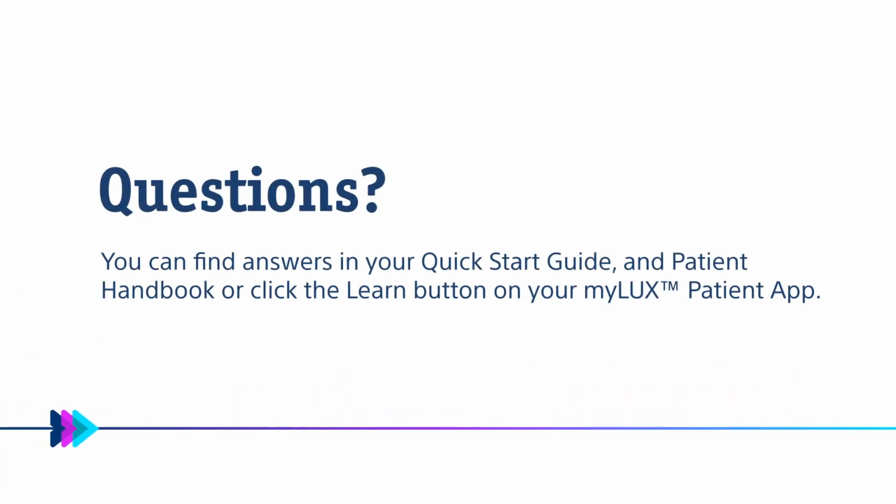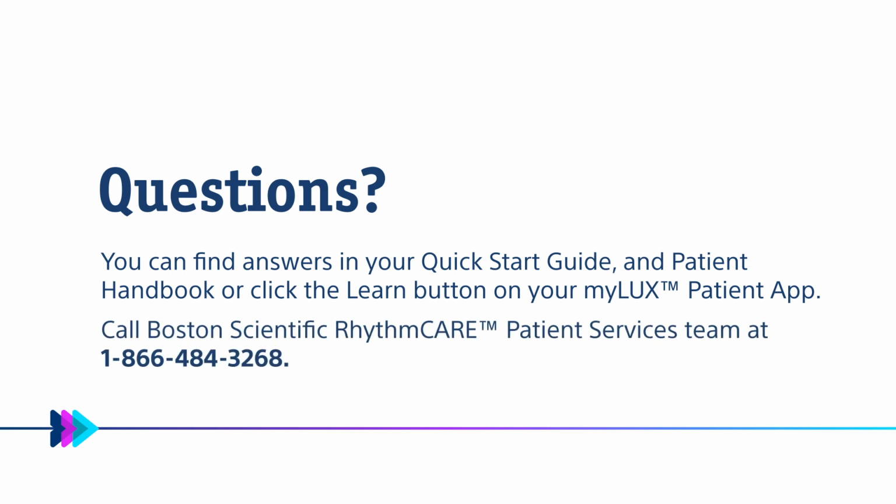Have questions about recording symptoms? You can find answers in your Quick Start Guide and Patient Handbook, or click the Learn button on your myLUX patient app. You can also call the Boston Scientific Rhythm Care Patient Services team at 1-866-484-3268.